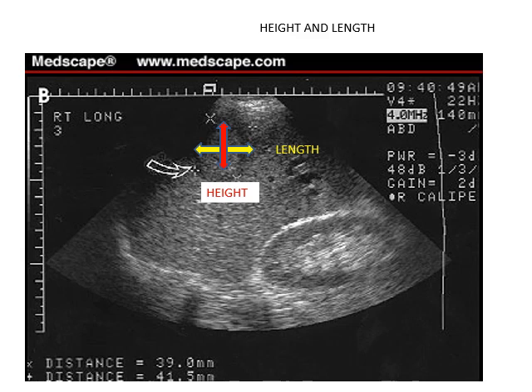All right, so that's probably what that's going to end up being, the volume of this little blob, whatever it is. Okay, maybe it's a little growth that's in the liver or something. All right, so that's going to give you your measurements. So when you get to fun with ultrasounds, you're going to be doing this, you're going to be measuring the length, the width, and the height, and you're going to use the scale that's on the side that I have made sure that I've given you a scale that's proper.